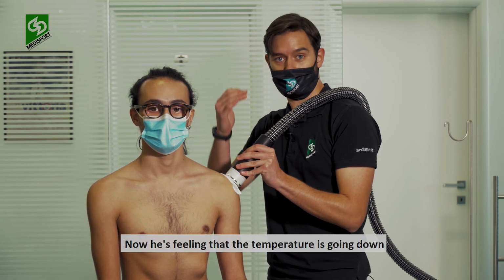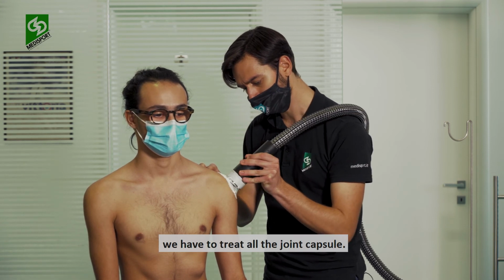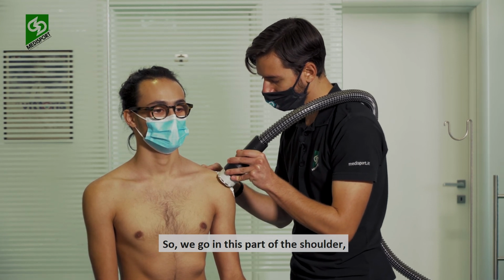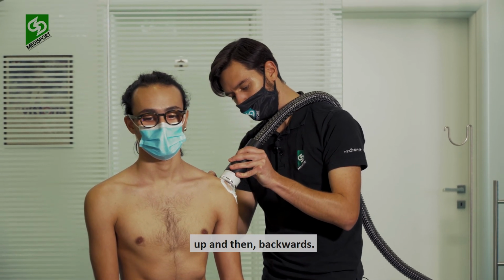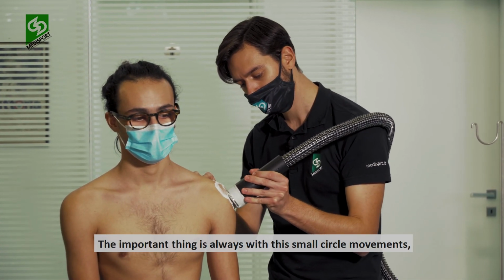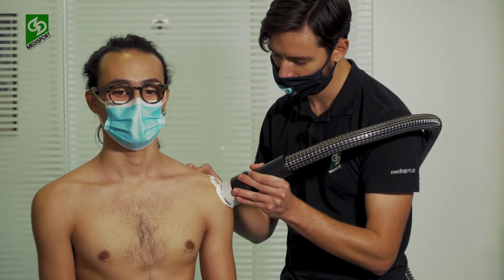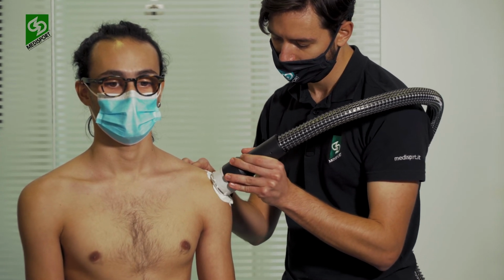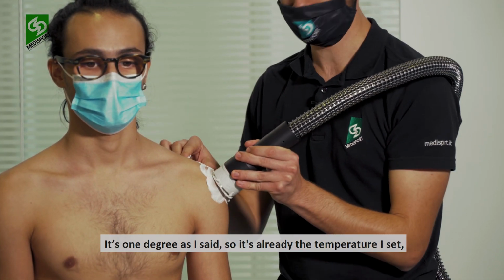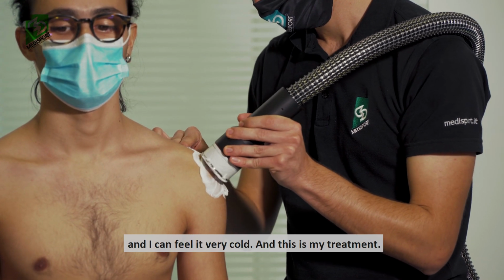Now he's feeling that the temperature is going down. And of course, as you know, for a frozen shoulder, we have to treat all the joint capsule. So we go in this part of the shoulder, up, and then backwards. The important thing is always with these small circle movements, very, very slow. We're not rushing. The temperature now is really good. It's 1 degree, as I said, already the temperature I set, and I can feel it very cold. And this is my treatment.